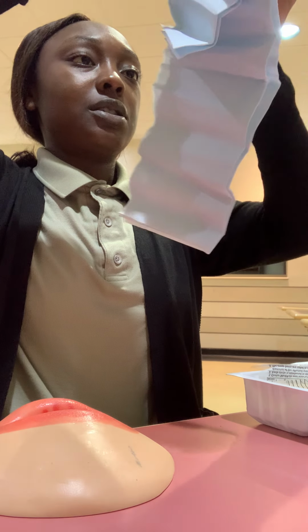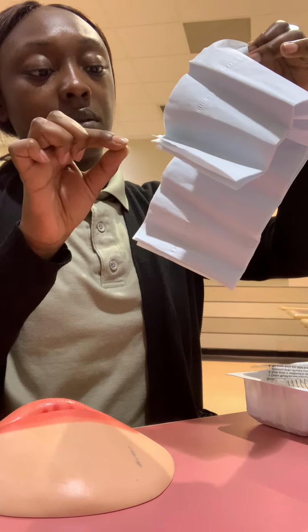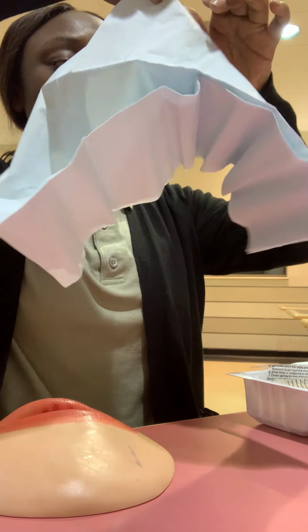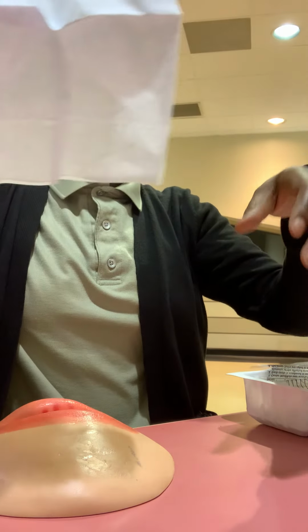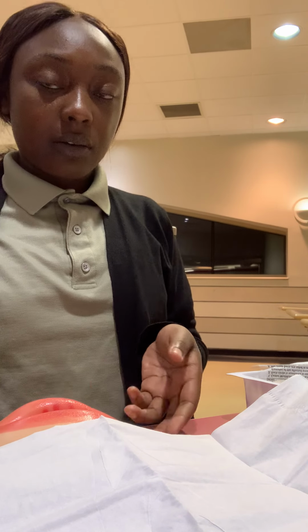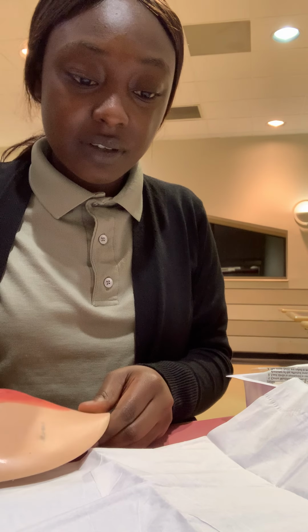And I'm only touching that 1/2 inch perimeter that I am allowed to touch. Okay, now my sterile field is laid out on my flat surface.